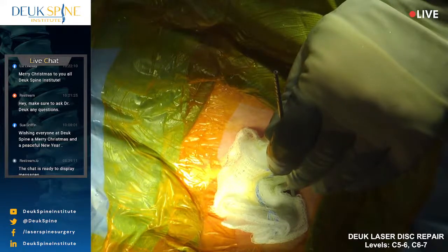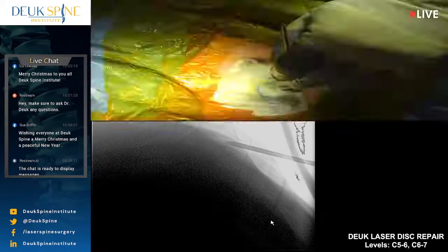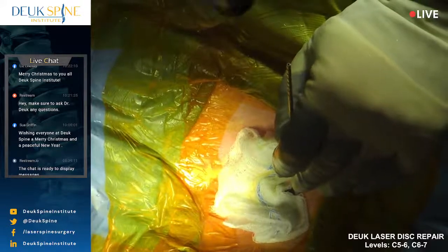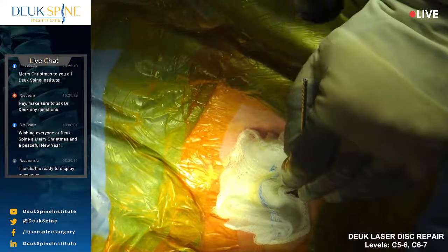Perfect. So what's happening is the dilator tip is tapered, and it will literally spread things apart. It doesn't hurt anything, except it could hurt the spinal cord or the nerve in the back if we're not careful. But I'm, of course, going to be very careful about that. But right now we're just going through the jelly in the middle of the disc called the nucleus pulposus.